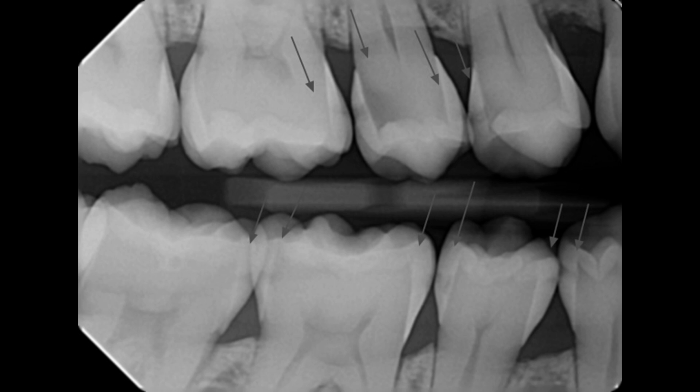When looking at bite wing x-rays to detect decay, it is important to open the contacts and not have any overlapping in the image. I will demonstrate how to do that here in a bit. If there is overlap, then it makes it difficult to see the cavity between the teeth due to the obscured view. If you look at this image here, we can see there's a cavity, it appears, between 30 and 31.